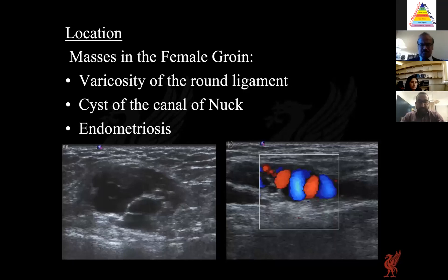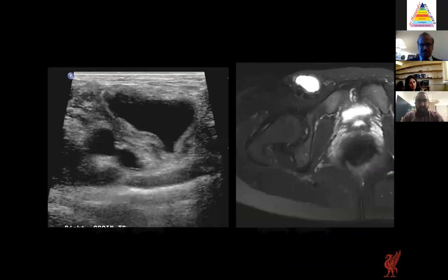Location is particularly important for masses in the female groin, especially around the inguinal ligament. One example showed a very well-defined lesion within the inguinal canal of a female patient — assessment for vascularity revealed prominent vessels, and this was diagnosed as a varicosity of the round ligament. Another cystic-looking lesion on both ultrasound and MRI in the female groin was most likely a cyst of the canal of Nuck given its position.